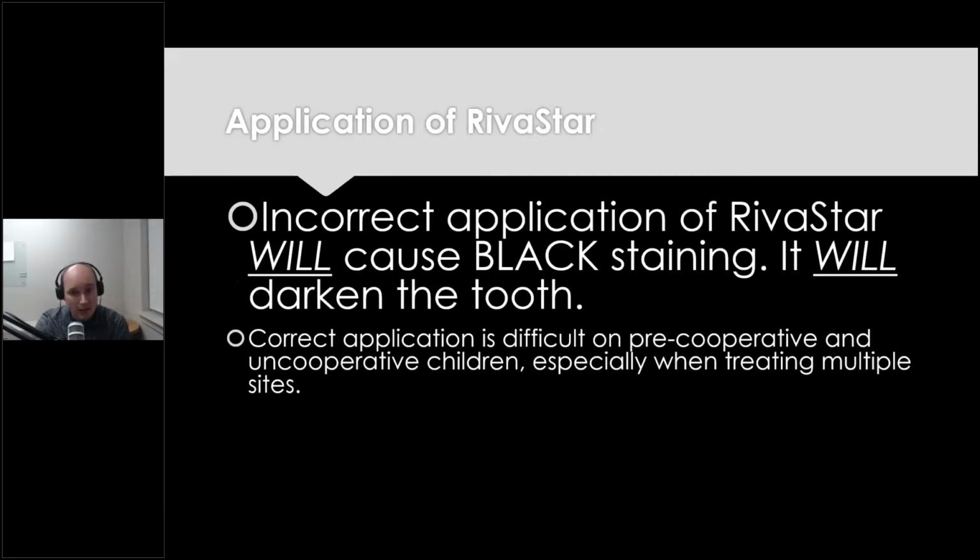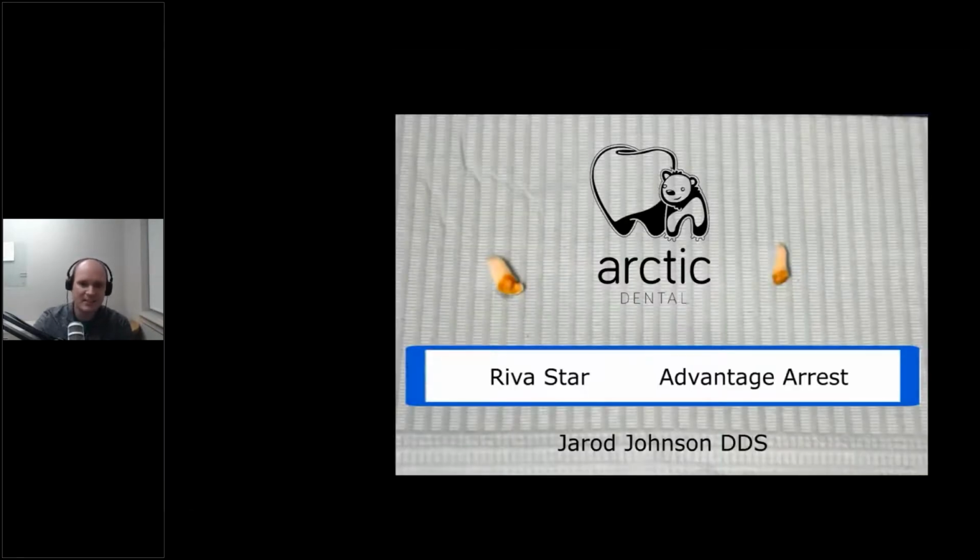As far as staining, it will stain the teeth. Incorrect placement will stain the teeth. I did a few. I got this video. I applied both products. Let me see if we can get this video going. This is a time-lapse video of these 2 extracted teeth, and here you can see the difference.